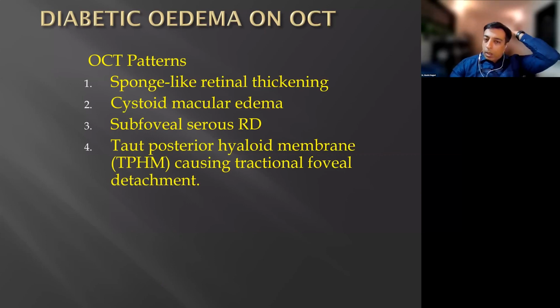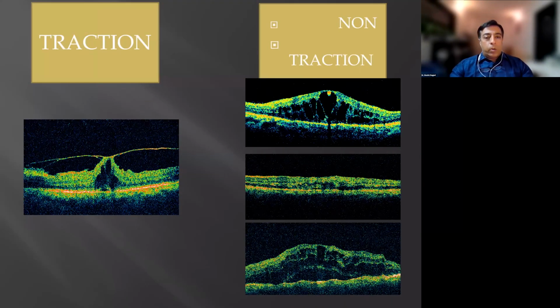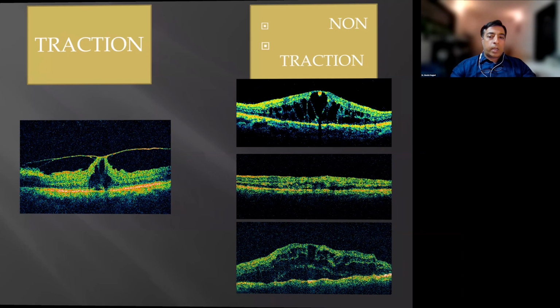Now, just a quick one for diabetic cases, and I don't want to get into the details. You could have traction with diabetic cases for which you operate, or you could do it for a chronic macular edema, which is not responding, or you feel that constantly requires injections.